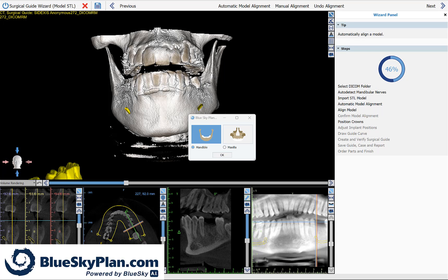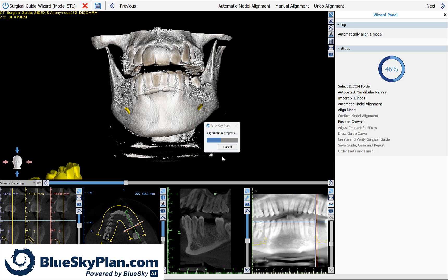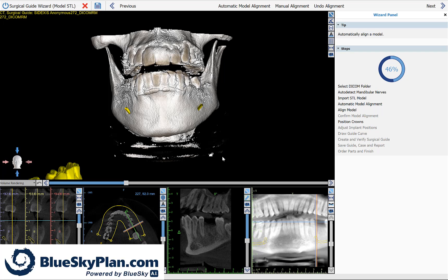Click on the relevant model type and the software will now run completely automatic model to CT scan alignment.